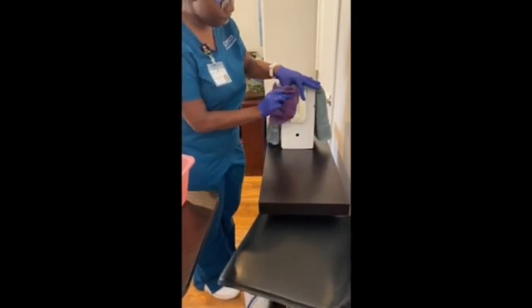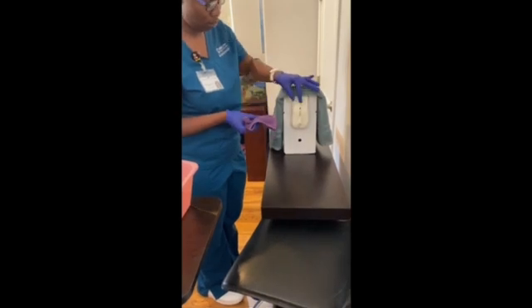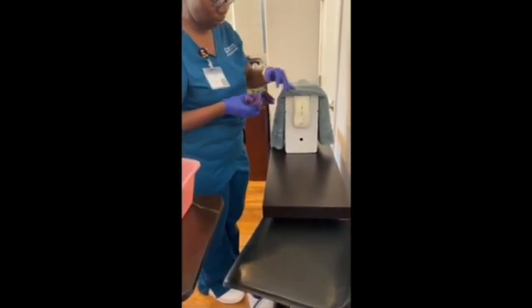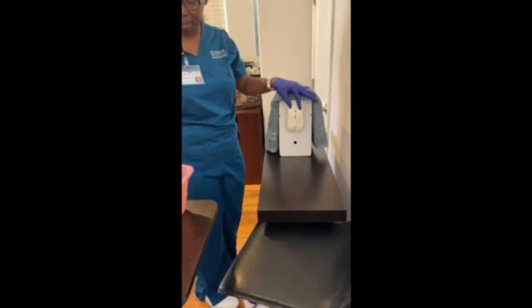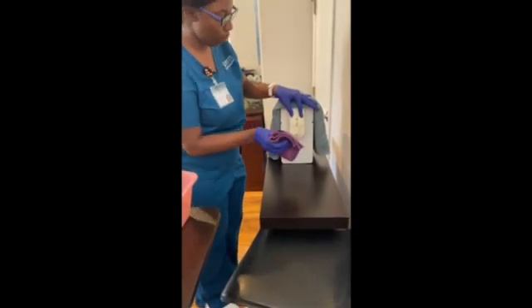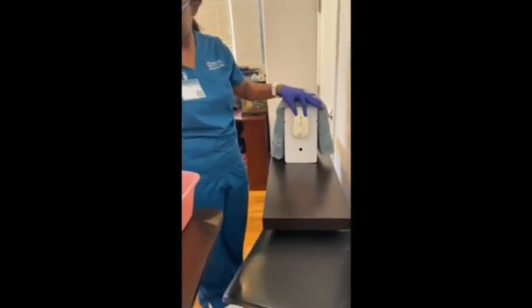closest outer labia, inner furthest labia, and inner closest labia. And this will go in the laundry bin. And then we will do one swipe down the middle, and that will go in the laundry bin as well.